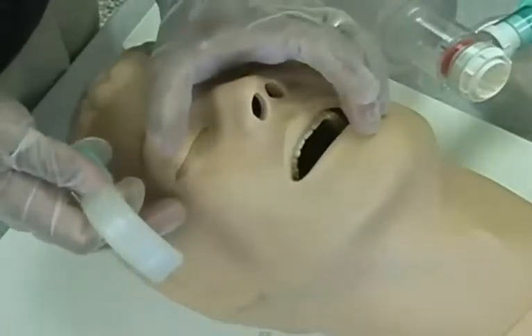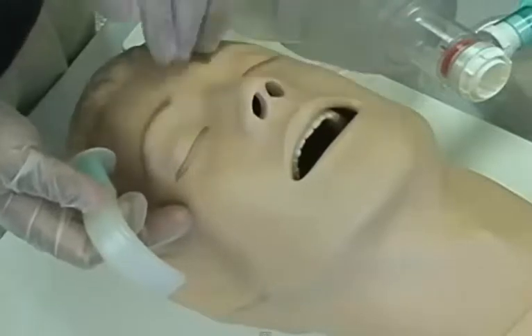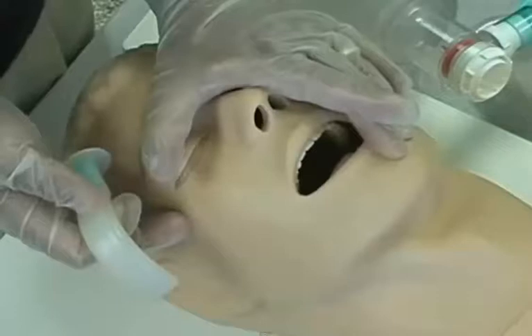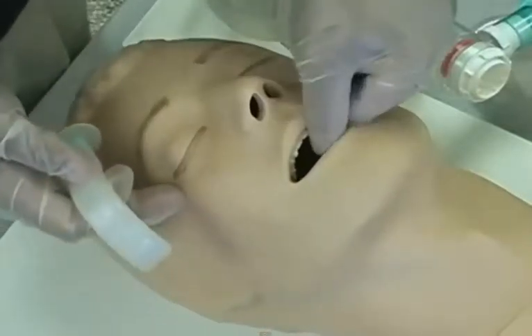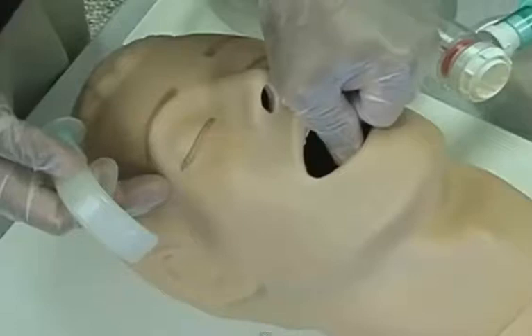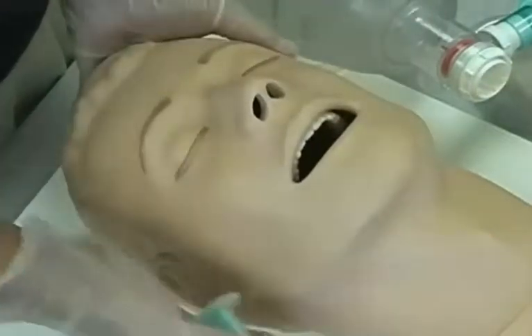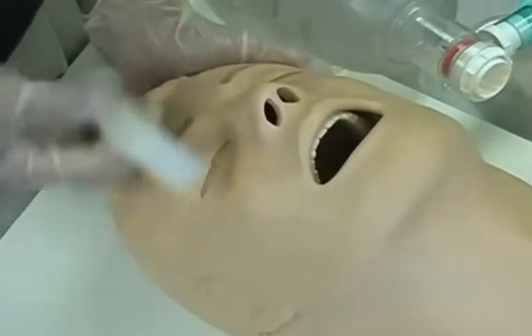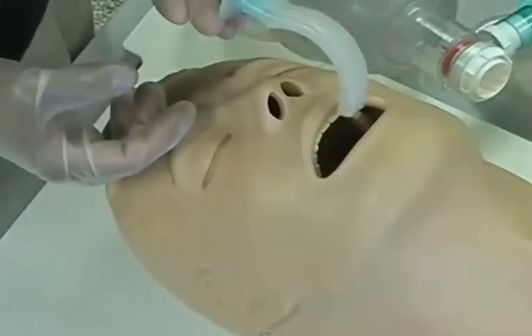Now when inserting an oropharyngeal airway, you want to make sure that you get a good wide mouth opening. There are several ways to open the mouth. One technique is to rest the palm of your hand on the forehead and push with your fingers to open the mouth. If you're confident that the patient is not going to bite down on you, the cross finger technique is good. Or, if there's no C-spine precaution worry, you can hyperextend the head. Any way that opens up the airway is acceptable.